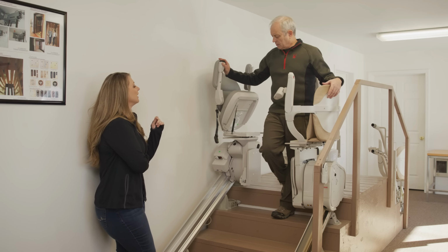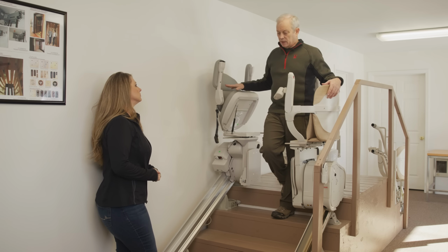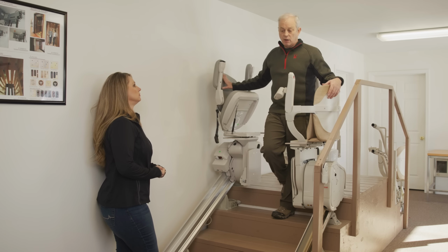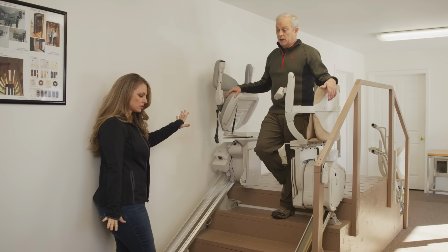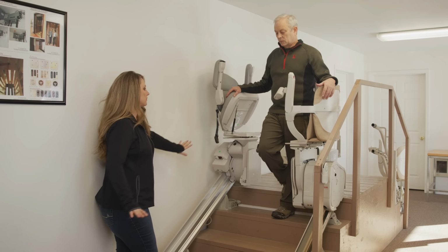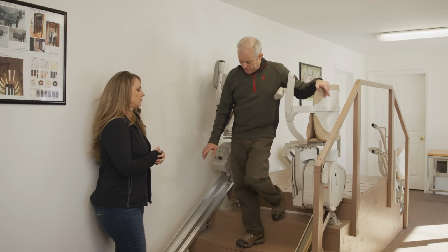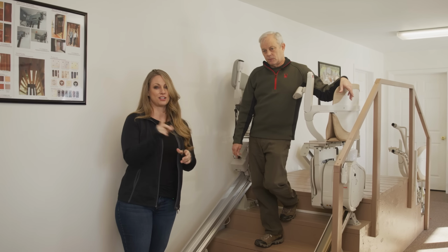No. When it comes to the temporary nature of it, I think the used equipment and then the ability to make it fit for the transfers is probably the most important. This is a larger chair. It sits a little higher. It's going to be a little tougher for certain individuals to transfer. The other chairs are a little bit lower. We talked about exterior lifts and ramps and the transfer areas. So that's something to definitely keep in mind when you're transferring the patient downstairs, upstairs, either way: always be safe for the caregiver too.